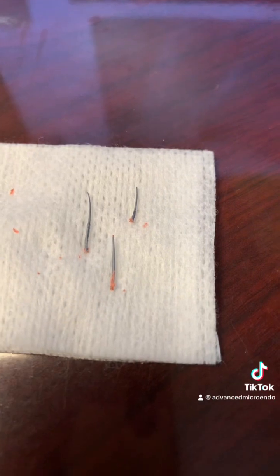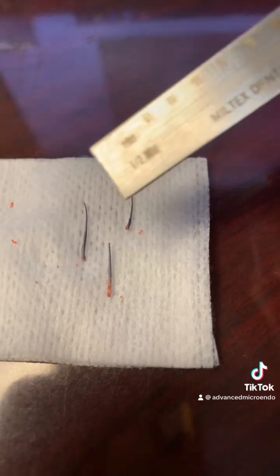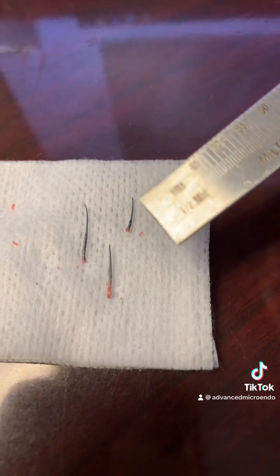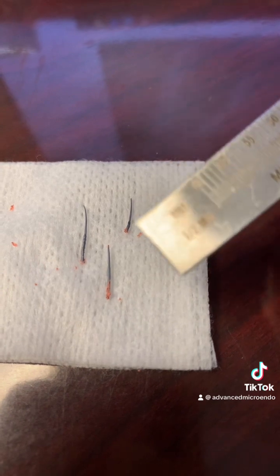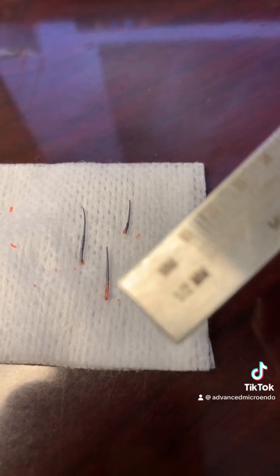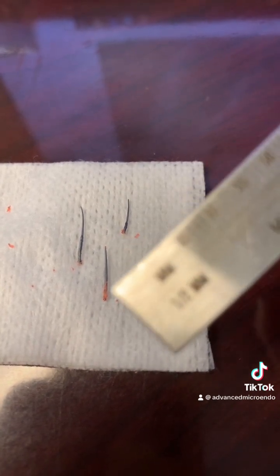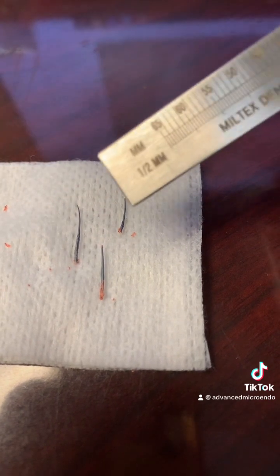These are the plastic thermafil obturators I pulled out of the canals. Okay, so this came out of the mesiobuccal, this came out of the mesiolingual, and you can see how short it is because, as I said, the dentist didn't instrument all the way to the working length in the mesiolingual, nor did he or she obturate it, or instrument and obturate the distal canal, and missed the canal on the distal as well. But that came out of the distal canal. This came out of the mesiobuccal, mesiolingual, and again, that came out of the distal canal.